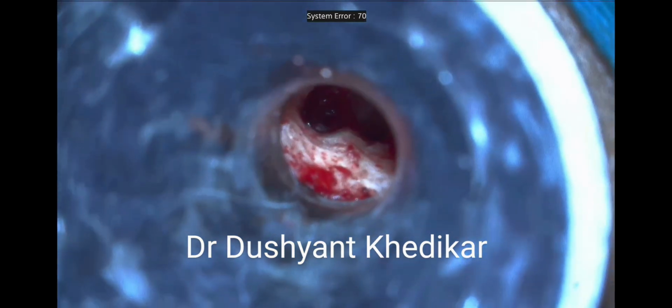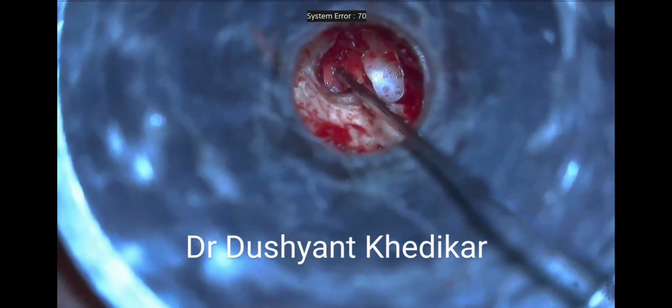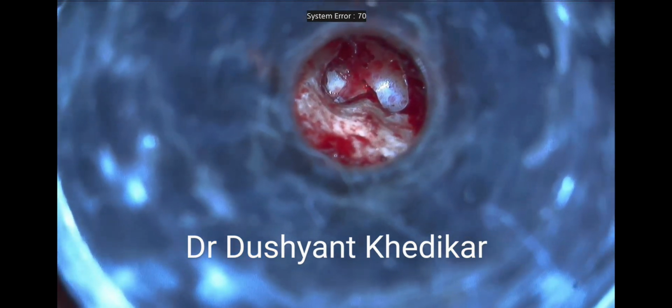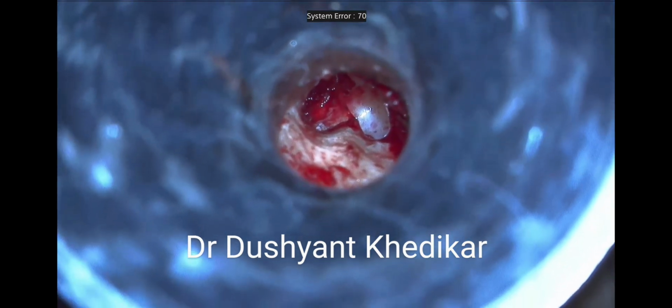Once you delineate the obliterative footplate, drilling is initiated on the footplate area in a circular fashion. The circular fashion of drilling over the footplate ensures uniform saucerization of the footplate. Uniform saucerization of the footplate minimizes the chances of accidental fracturing of the footplate.